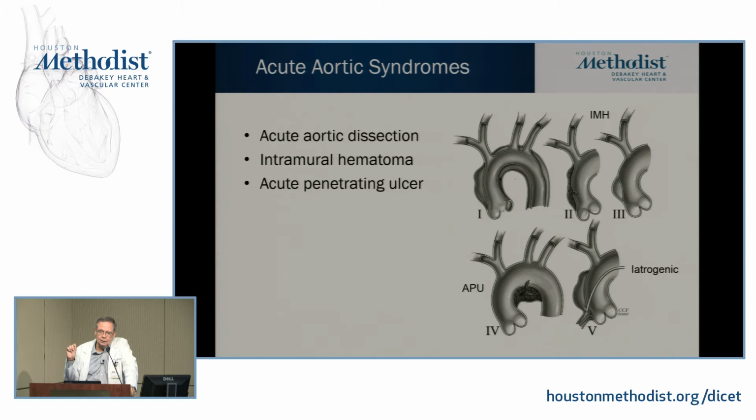Remember that the CT that FAISAL showed you is gated CT. Very important. You didn't use that term, but I like to stress it. It's what we do here. Now, more and more institutions are beginning to use gated CT, but still many places out there have the good old radiology sitting in the box doing a regular CT. And there are big differences in quality and resolution between that type of CT and the gated CT, and forget about CMR. Many places still don't have the quality that we have here. So you may have to pick up your probe and use it in these entities.